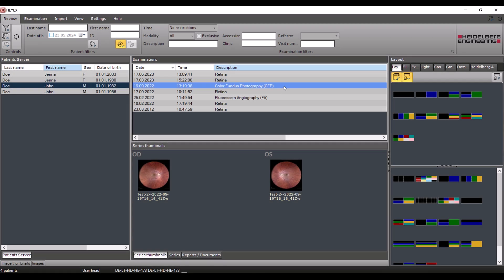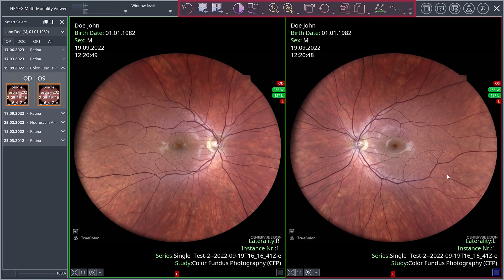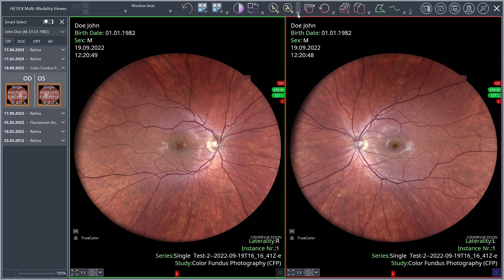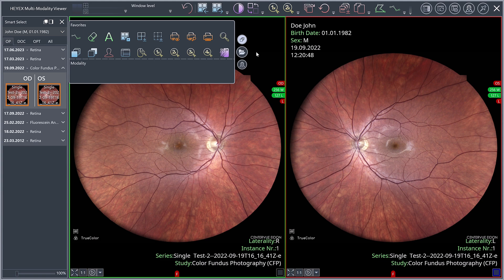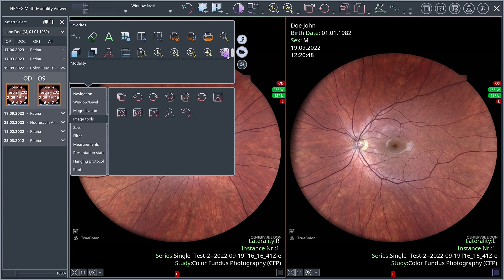This chapter provides an overview of some of the useful tools available in the Multi-Modality Viewer. As an example, we will open two fundus images in a layout with two viewports. In the ribbon bar, you can find the tools divided into categories. Click on the small triangle on the right-hand side of each category to display additional tools. You can also access the tools via the context menu that appears when right clicking in any viewport. Click Show All Functions to list all tool categories. You can use the drag and drop function to add your favourites in the context menu.